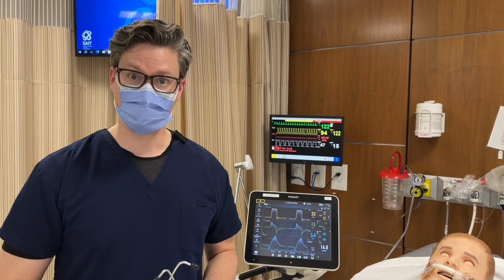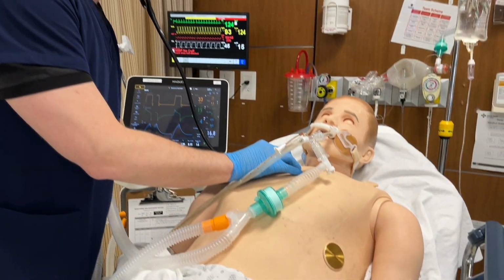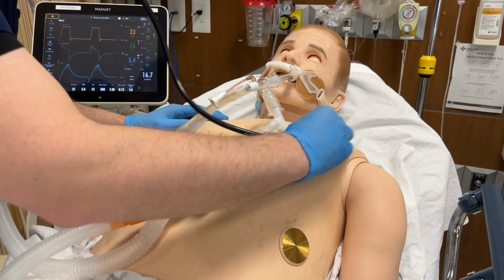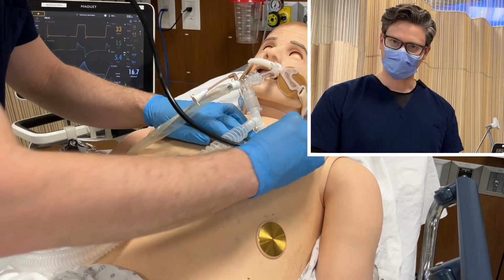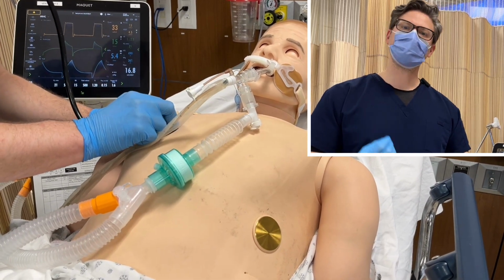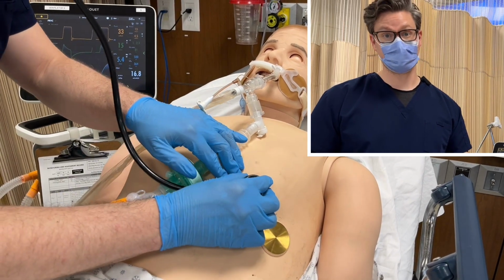What we're going to do next is we're going to auscultate the patient. When we auscultate, we'll listen to one side of the lungs and compare it to the next. Remember, after auscultation, if you heard coarse crackles within the lungs, that's an indication to suction. At this point in time, we will stop our assessment and intervene and suction our patient.